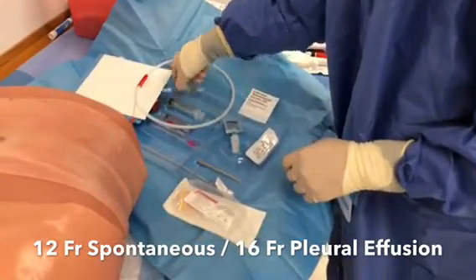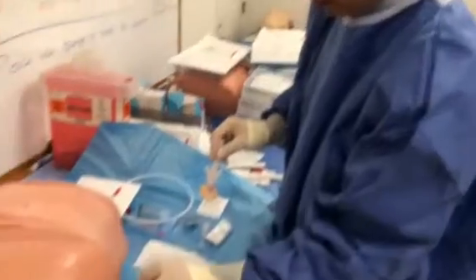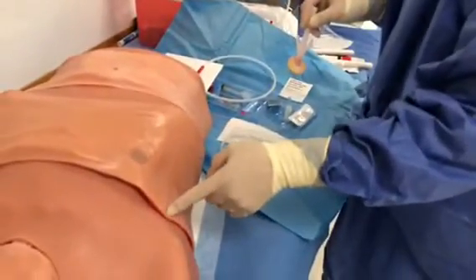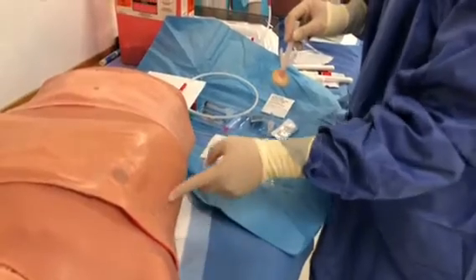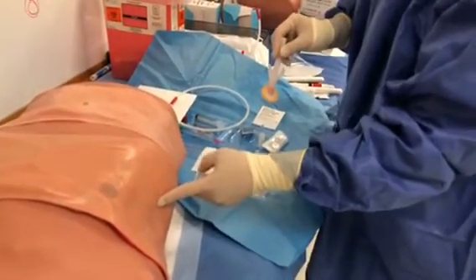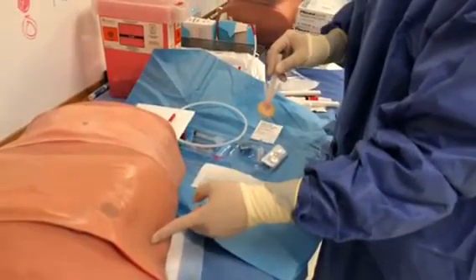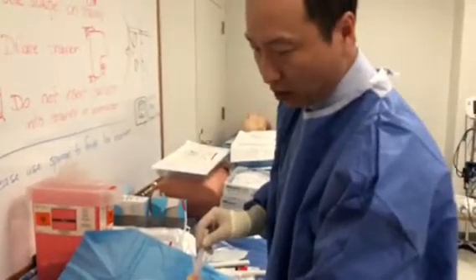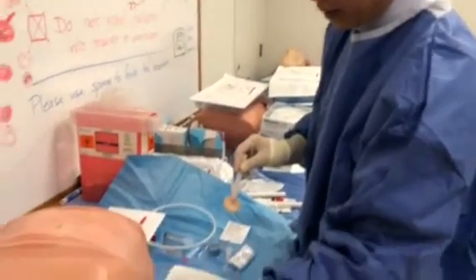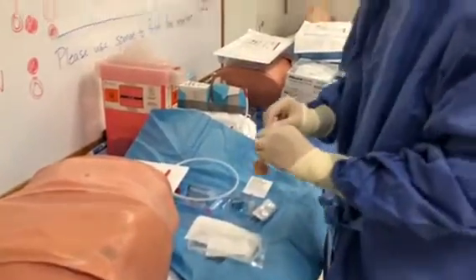We have a 12 French catheter here. I usually place either anterior axillary or mid-axillary at the 6th or 7th intercostal space. Usually 6th would be the safest, either for effusion or pneumothorax. If you're unsure, you could go right lateral to the nipple line and go high up, and you should be able to get into that. This kit is very safe.